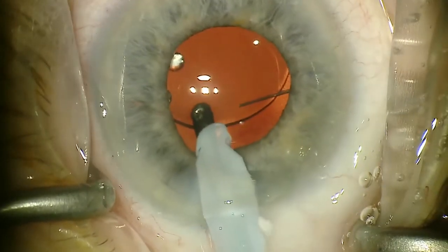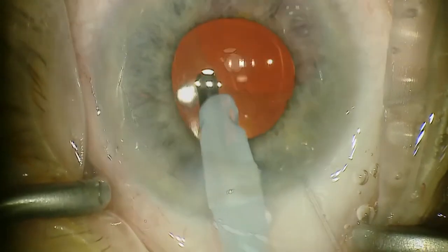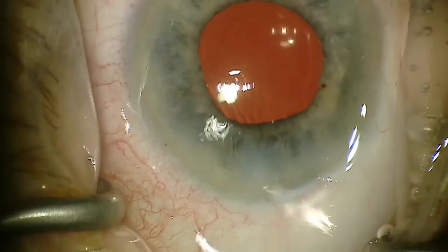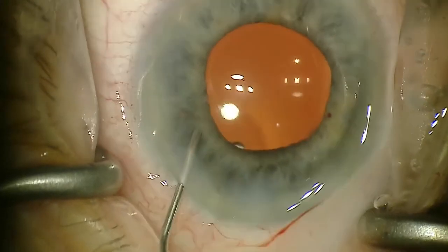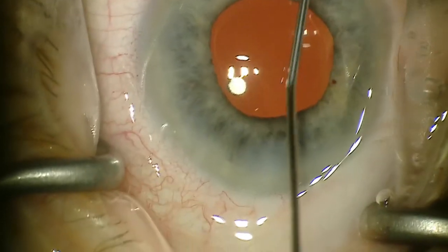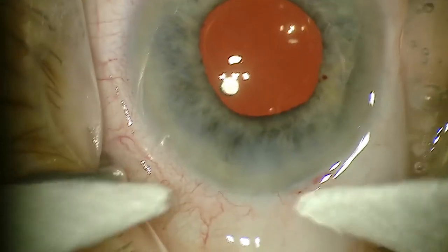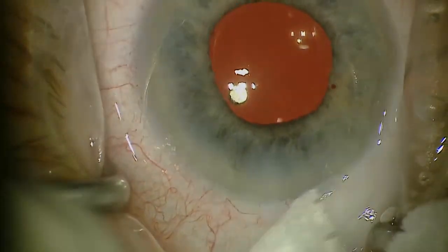Take the viscoelastic out with the IA tip and always go under the IOL just to get any remaining viscoelastic out. After you've sufficiently removed all the viscoelastic from underneath the IOL, get the remaining viscoelastic in the angle and then hydrate your wound. You'll get good wound sealant, which is typically pretty easy without extra sealant. I appreciate you watching this video. I hope this helps for anyone wanting to do the Kahook Dual Blade as well as ECP.